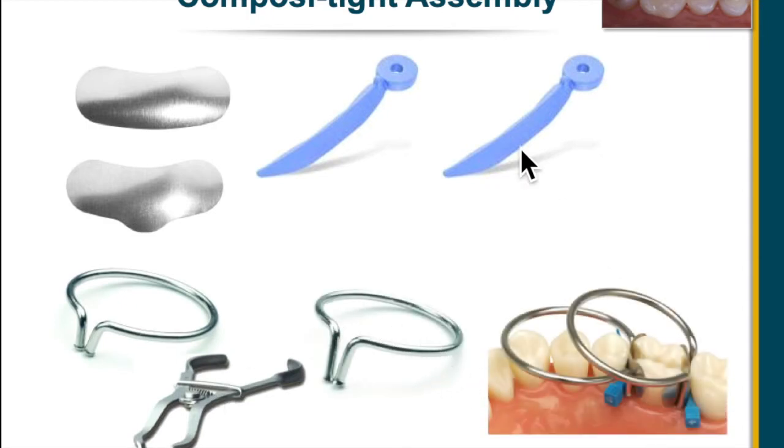And when it's all put together, you can see the metal matrix band is here, the wedges are here, and the rings are here. And the purpose of the rings is to help hold the matrix band in place and squeeze the teeth apart a little bit so that when you remove the matrix band, the teeth are actually touching each other, so there's good contact between the teeth.